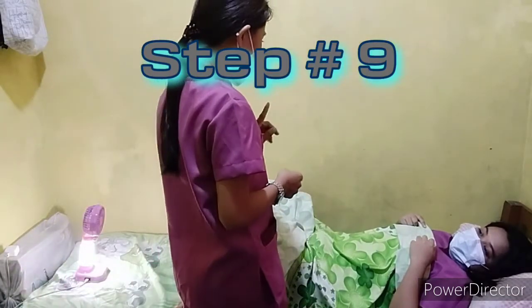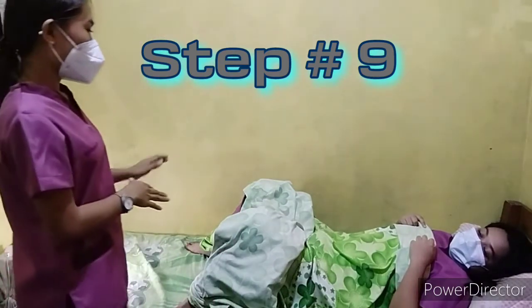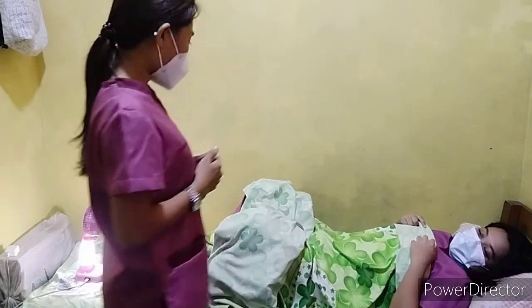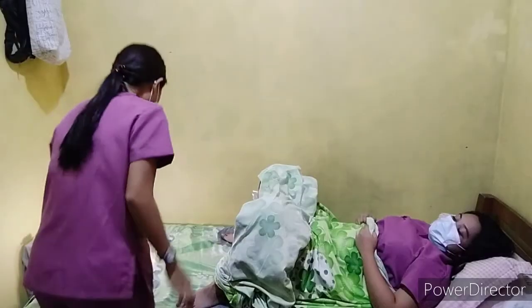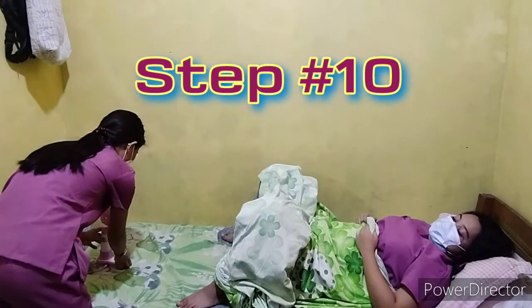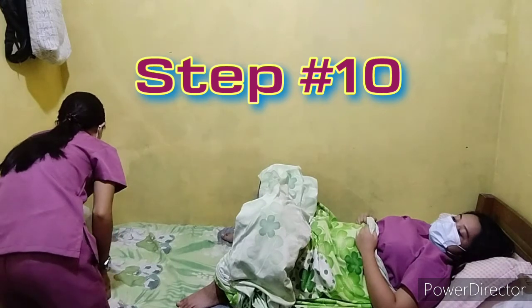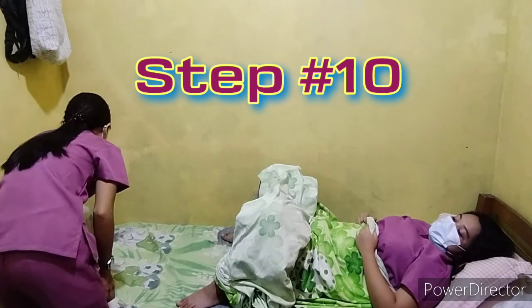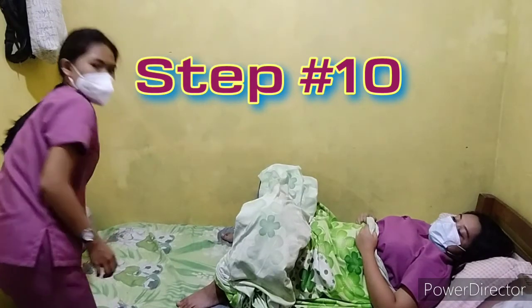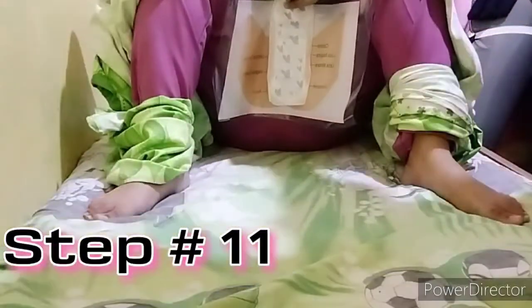And 9, instruct the patient not to change position nor to touch the lamp, to ensure continuous target area exposure and ensure safety. For step number 10, remove the lamp after 15 to 20 minutes and check the area for burning or untoward reaction. The desired amount of time of Peri-Light exposure as ordered by the physician can prevent skin burn or any unfavorable skin reaction.